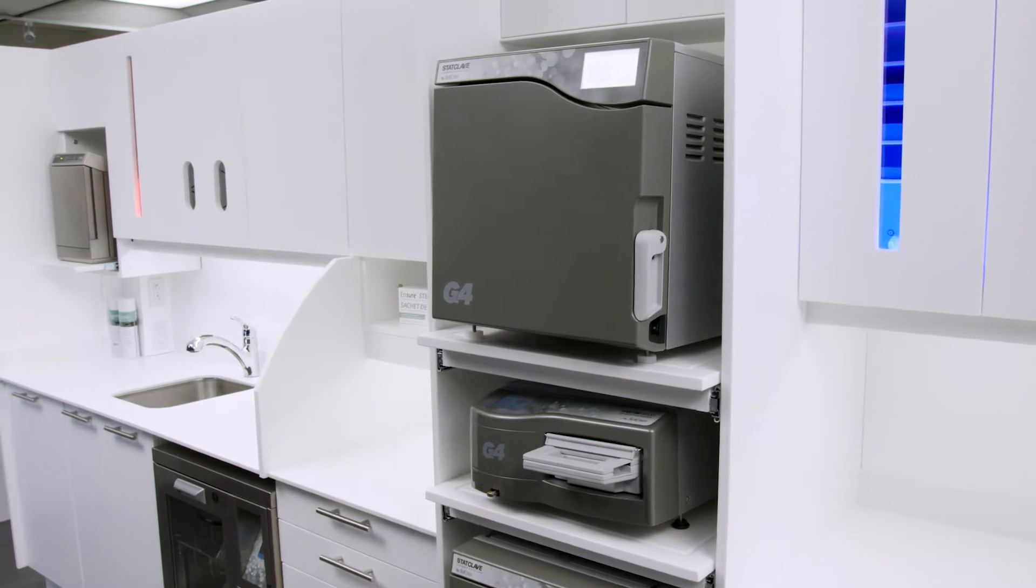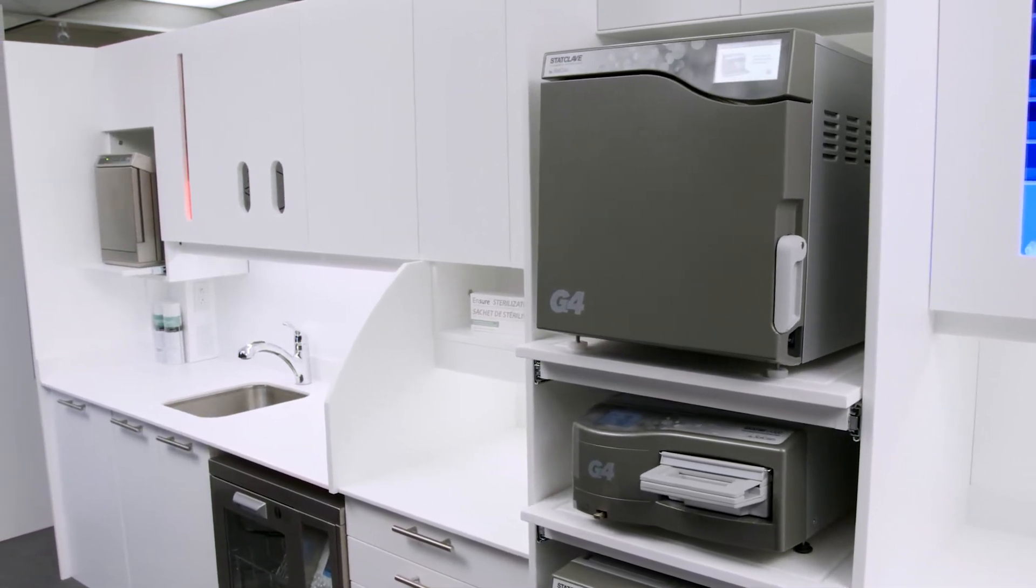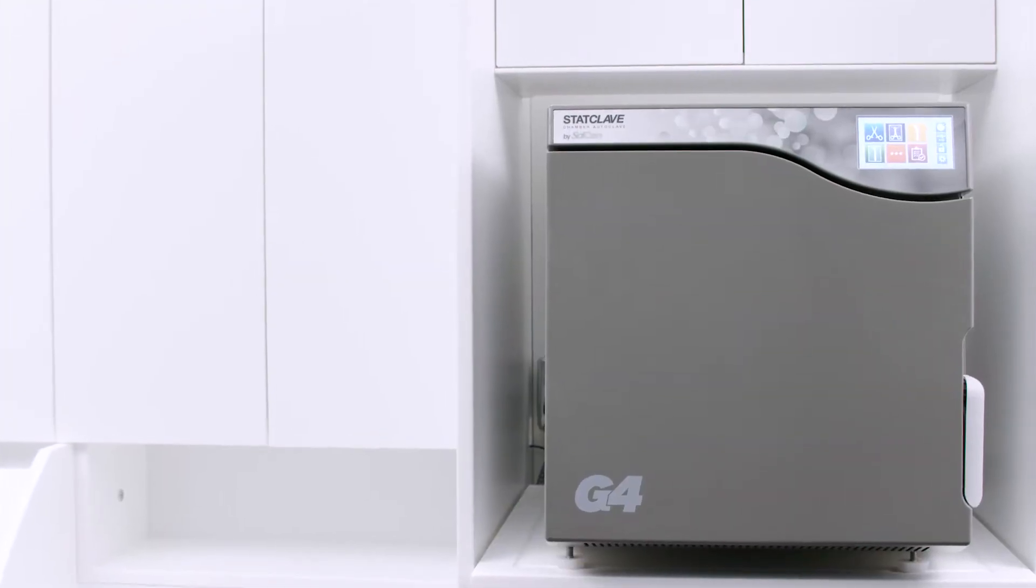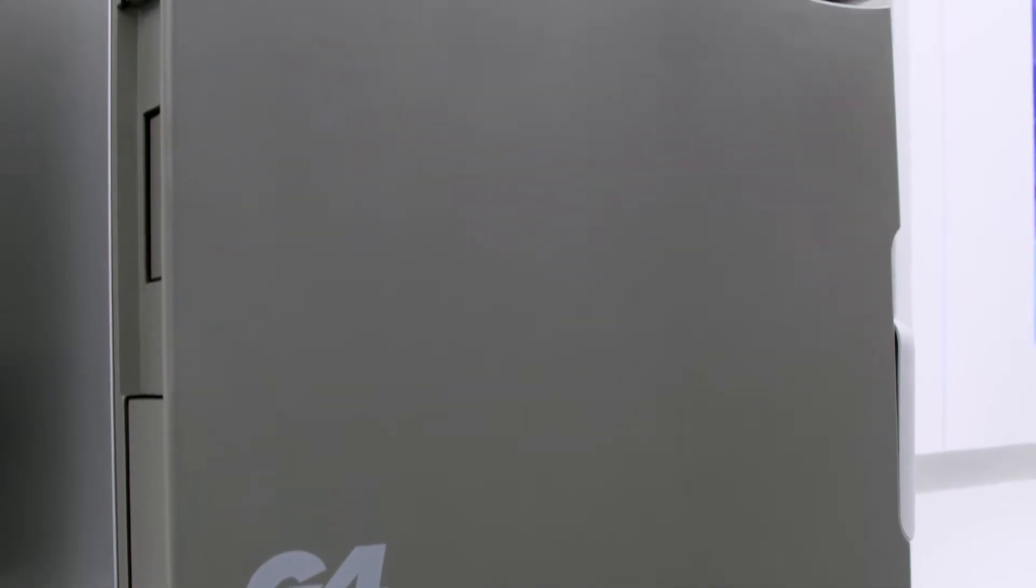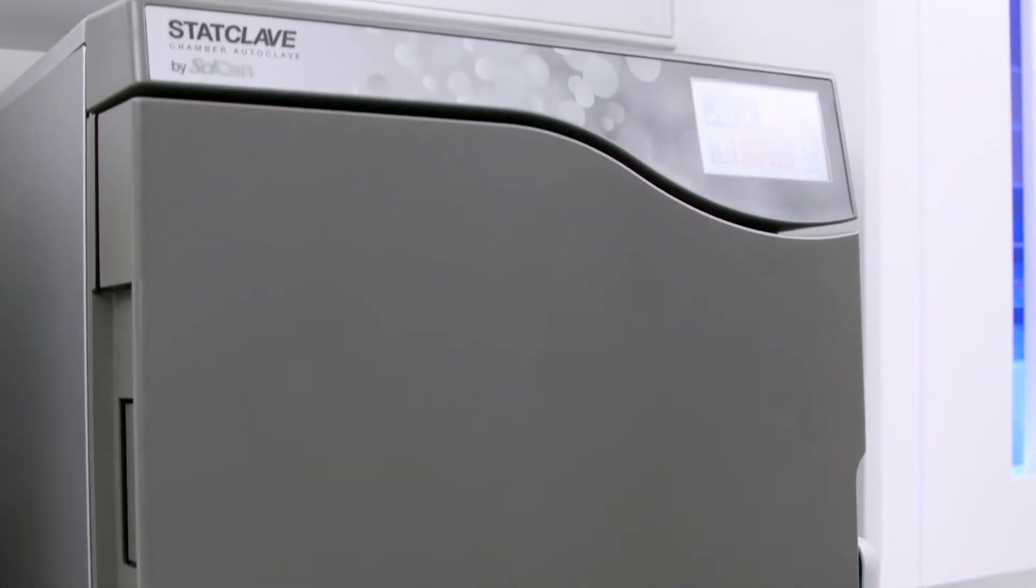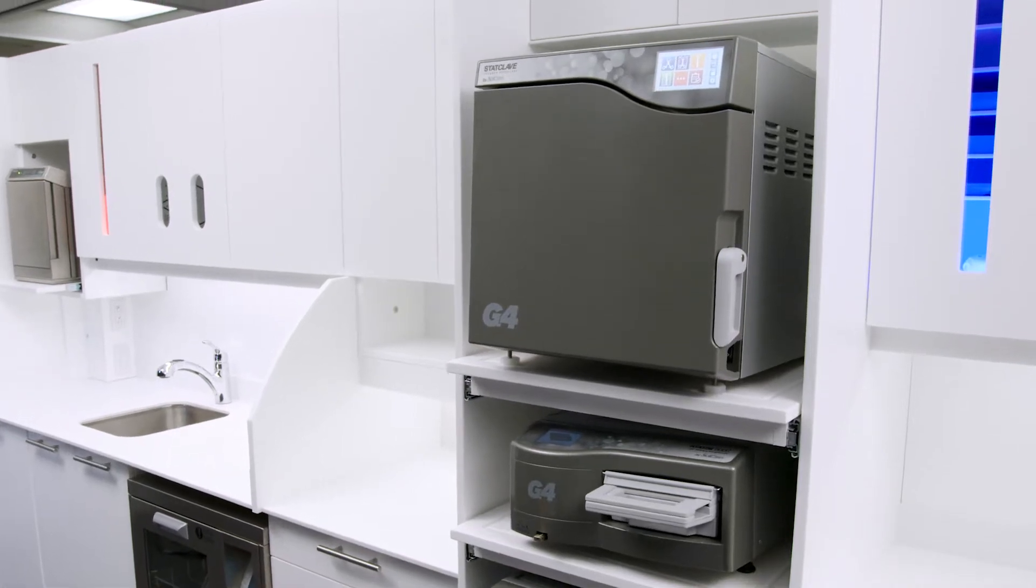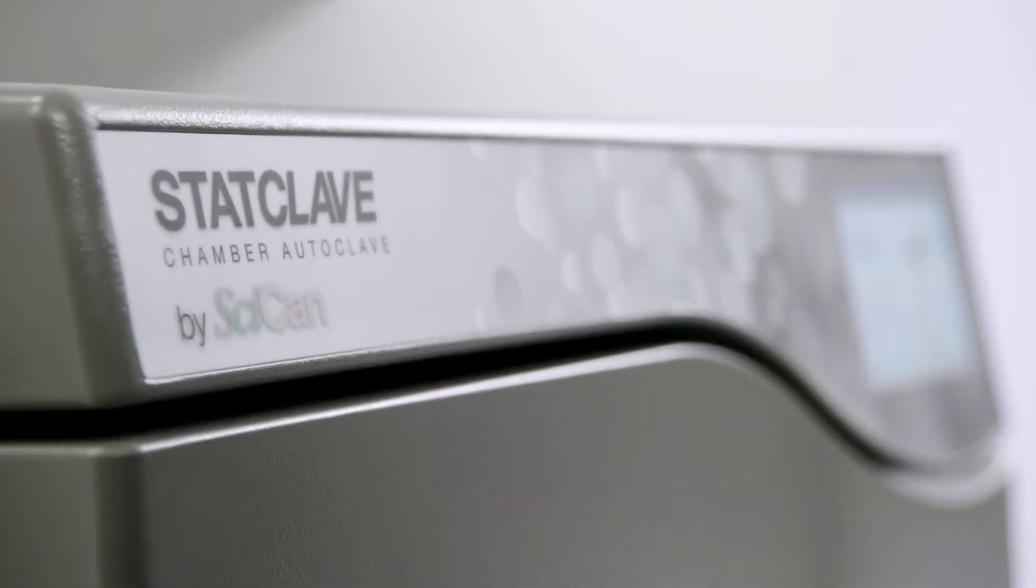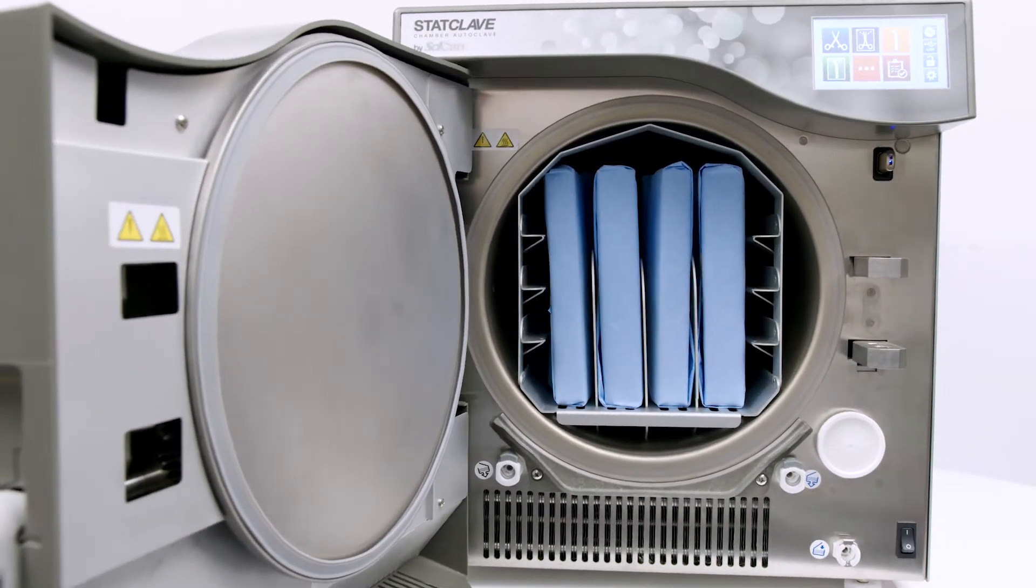Thank you for adding the StatClave G4 Chamber autoclave to your practice. The StatClave is SICAN's Chamber autoclave designed with safety, performance, flexibility and ease of use in mind. StatClave G4 incorporates both a vacuum at the start of the cycle to remove air and ensure perfect steam penetration and a vacuum at the end of the cycle to remove moist air so that your instruments are dry the moment you open the door.